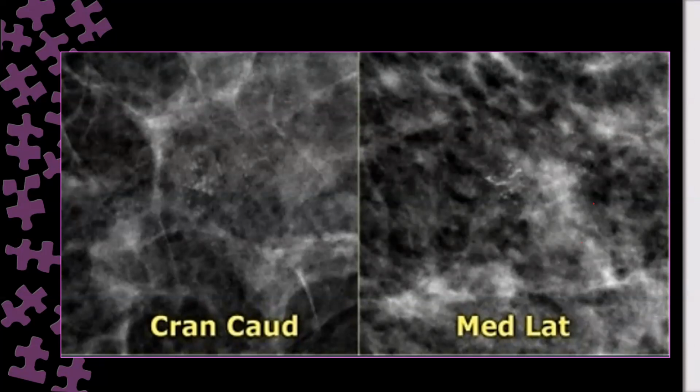The previous case will say extensive. We have to differentiate between extensive and diffuse. Okay? When we go again, to discuss it in more details, but at least now this is a group of classification.